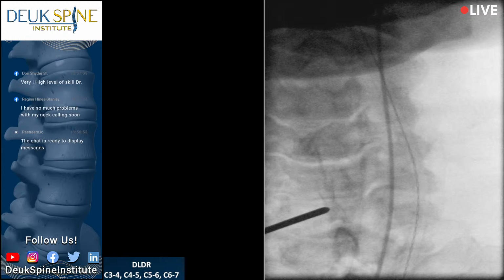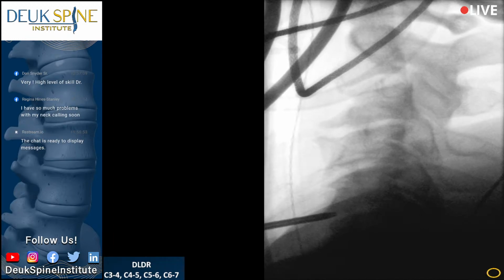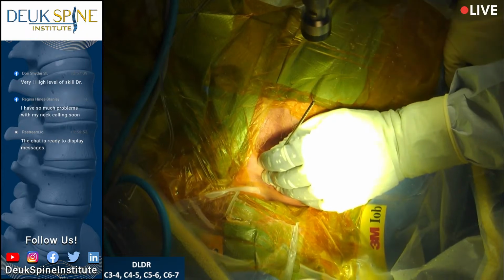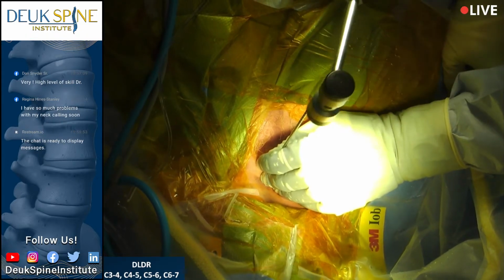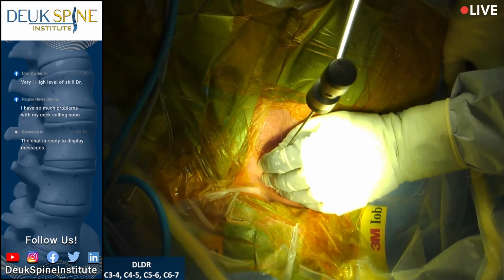So I'm sliding along the front of the spine, quite literally sliding along the anterior longitudinal ligament. Perfect. Shot. Oh my gosh, I can't believe we did it. Shot. You guys are the best. Honestly, I don't believe anything those other people say about you.